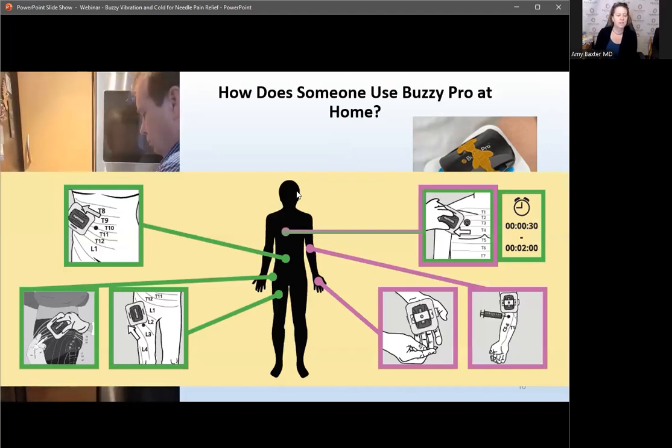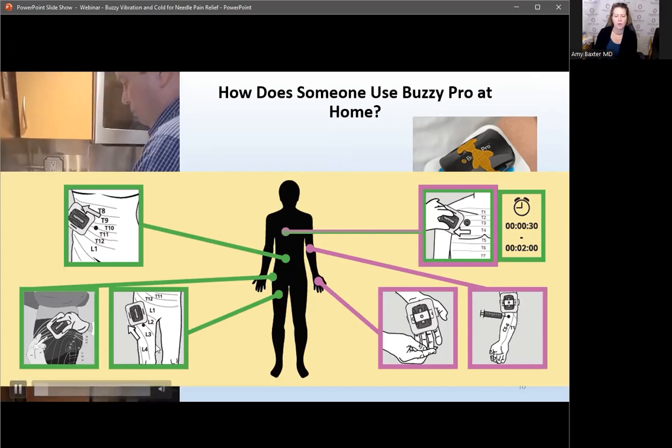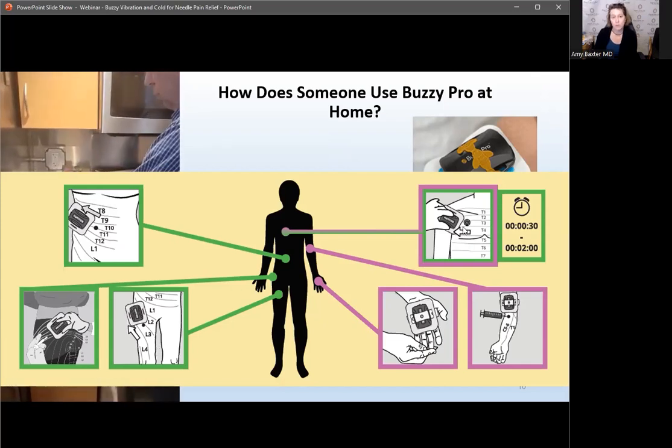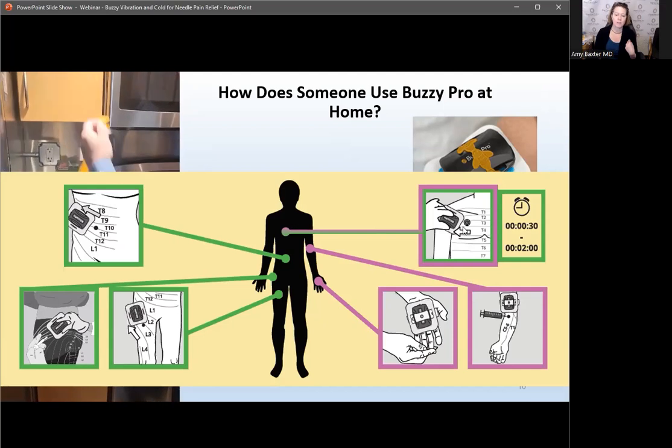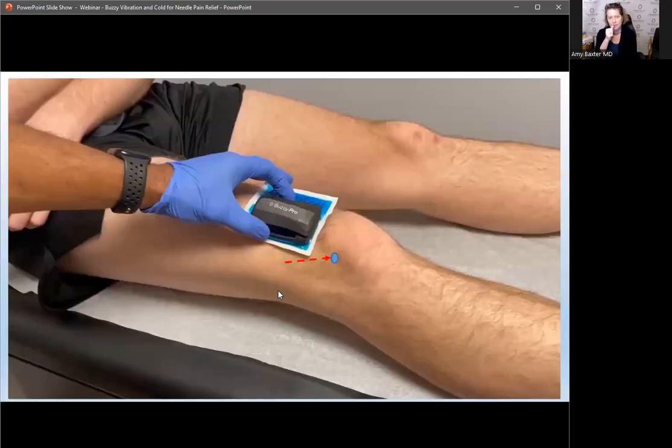So again, looking at the different places on the body where the unit can go, you need to know where the dermatomes are so that you can move Buzzy between the brain and the pain. And this is an interesting thing for dermatomes and PRP. As you can see here, the PRP injection is going to go lateral to the side of the knee. This could also be a joint aspiration in rheumatology.